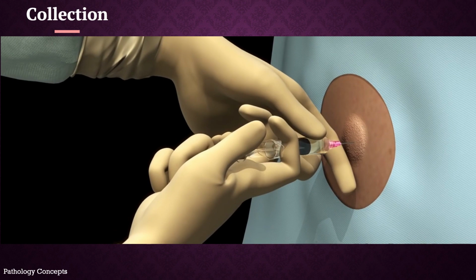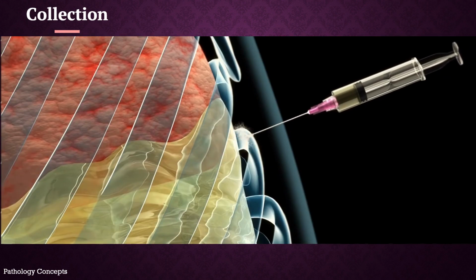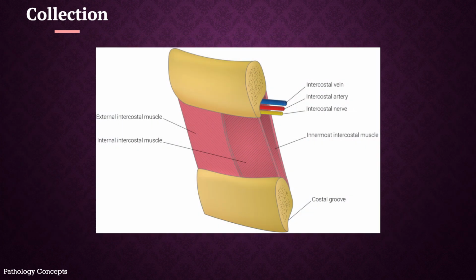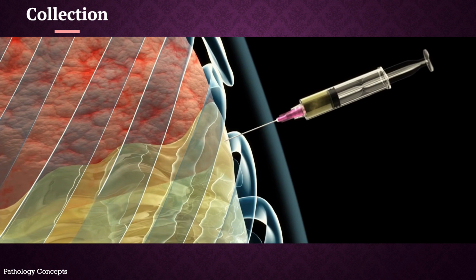Prep and wrap the patient in a sterile fashion. Cleanse the skin with antiseptic solution. Administer local anesthesia to skin and soft tissue. Depending on the catheter used for thoracocentesis, a single stab incision through the superficial skin of the anesthetized area will facilitate the passage of the catheter. The intercostal neurovascular bundle is located along the lower edge of the rib. So the needle must be placed over the upper edge of the rib to avoid damage to this neurovascular bundle.